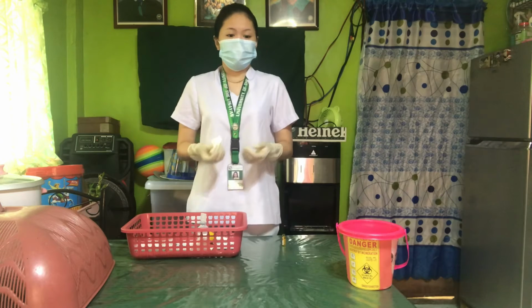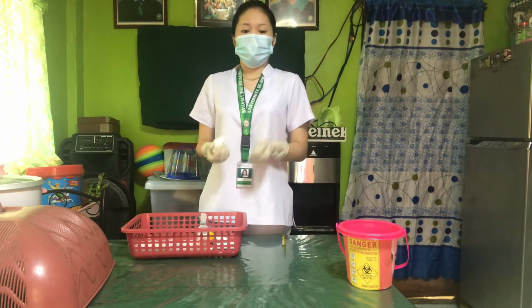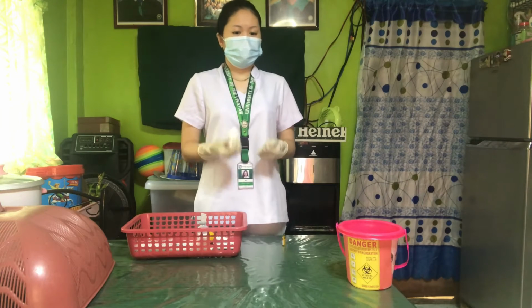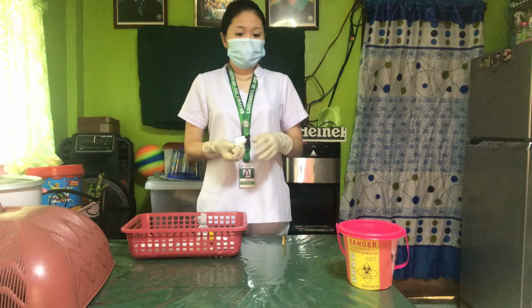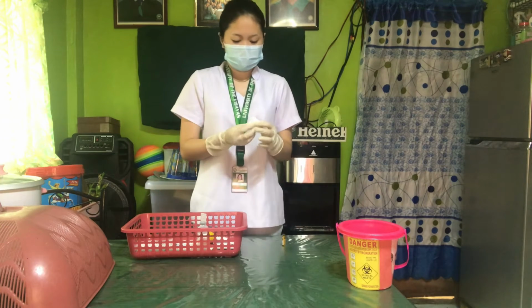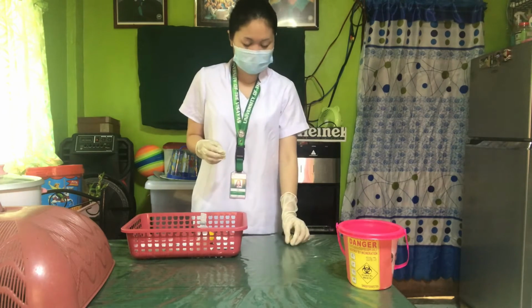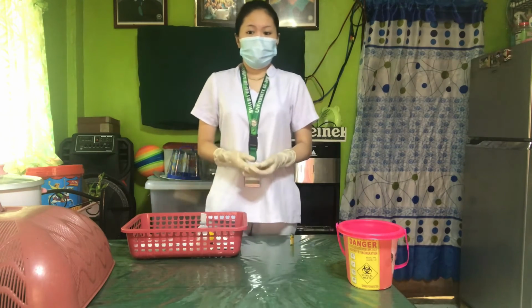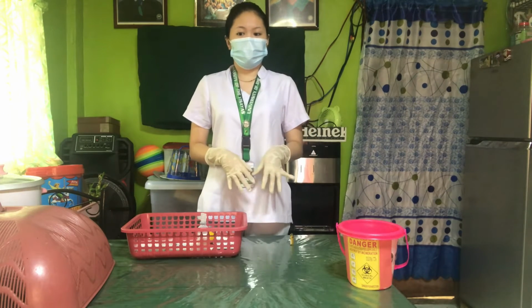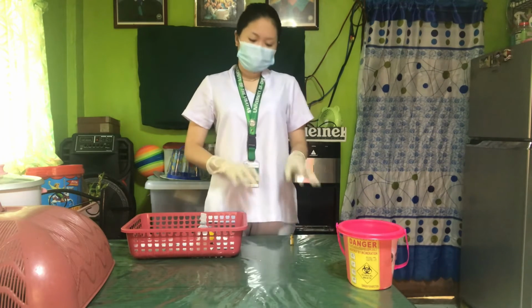Next is dispose the top of the ampule in the sharps container. This is to prevent wounds and punctures of loose sharps. Assuming that this is a sharp bin container. Next is place the ampule on a flat surface because the solution dribbles out when the ampule is inverted, so put it on a flat surface.